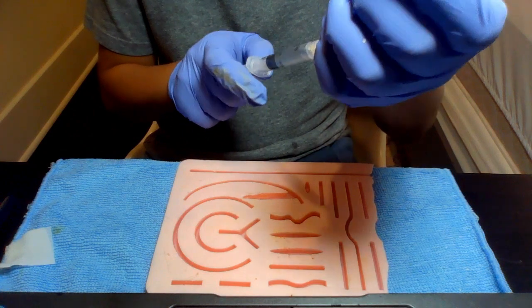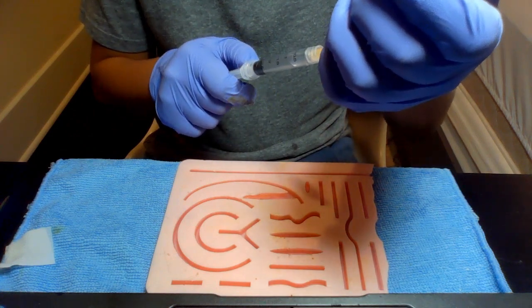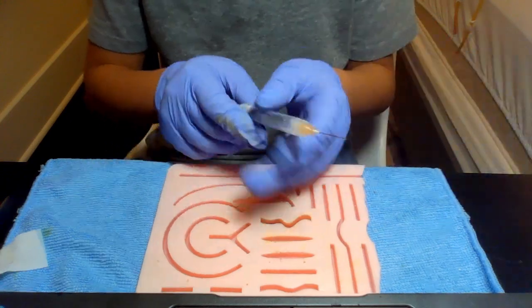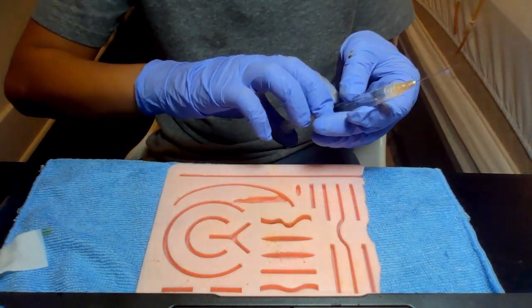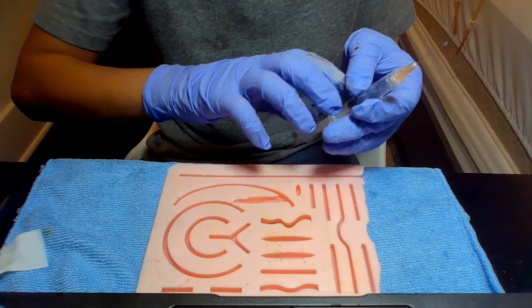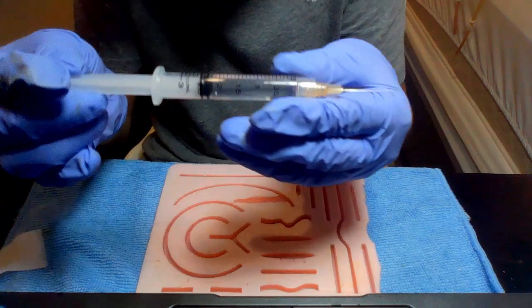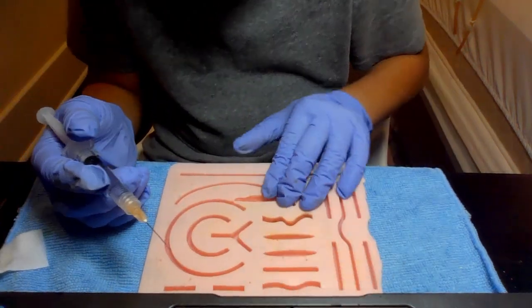Sometimes it does get a little bit hard. Now, if there's any air in it, like there is right there, tap it. And then there we go. That's our syringe of lidocaine.